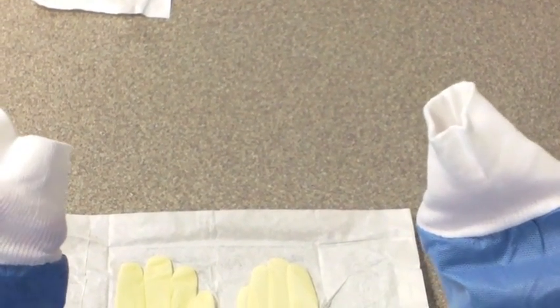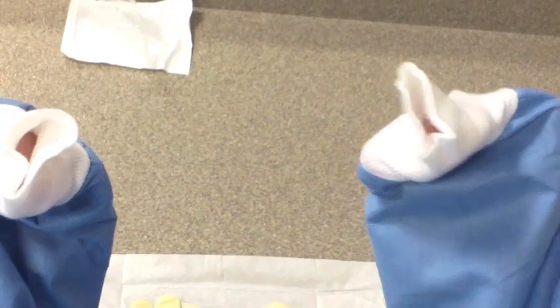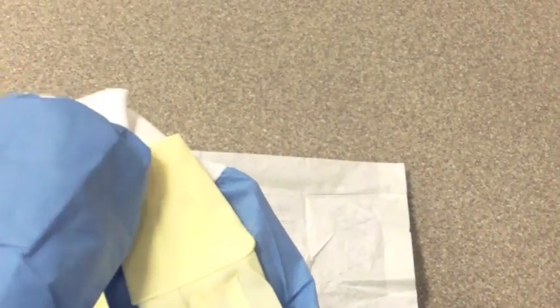Make sure that your fingers never come outside the sterile gown. Start with the right glove — grasp it at its cuff, lift it up and lay it on your arm. Now grasp the two ends of the glove and push your fingers through, always keeping your fingers inside the gown until it is fully inside the glove.